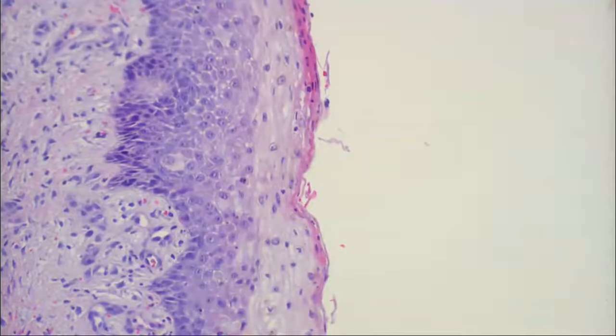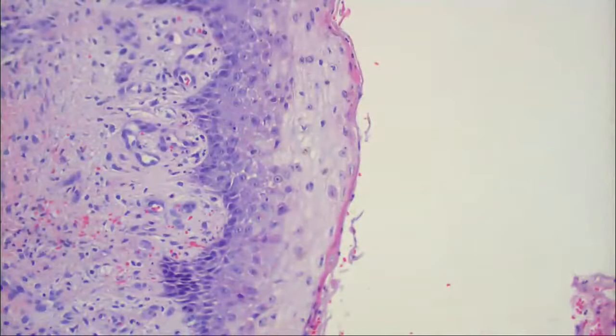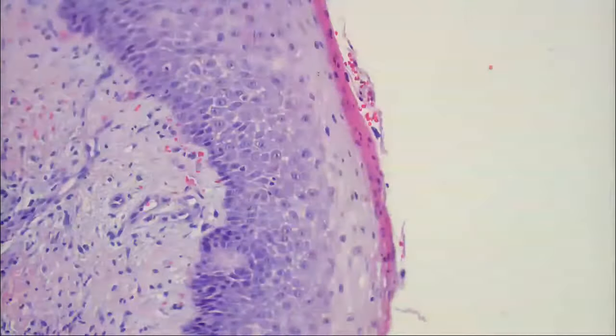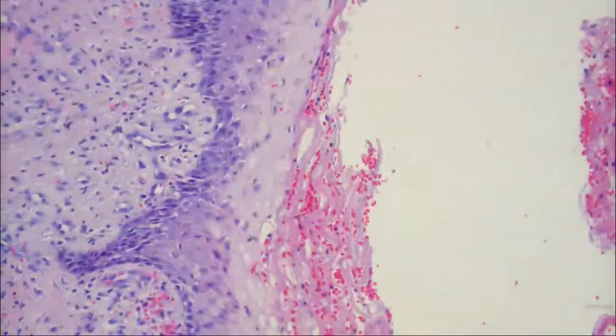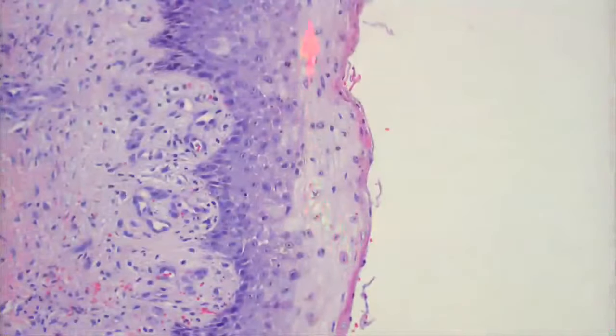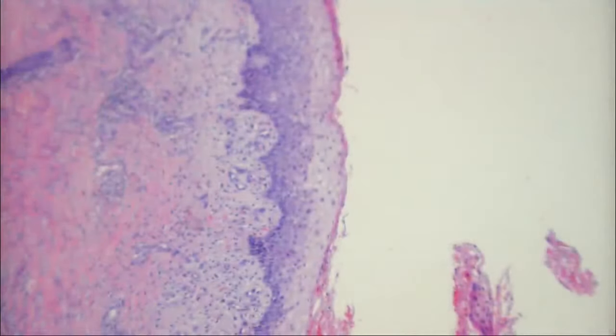Not easy, but there's just one other thing really that can kind of do it. Sunburn? No, that gives you dyskeratotic keratinocytes. Anybody know? Irritant dermatitis sometimes. If you apply gasoline or something like that, sometimes you can get it up there. But this is pretty much almost pathognomonic. So which disease is that on the left? Also the right too, but especially on the left there.